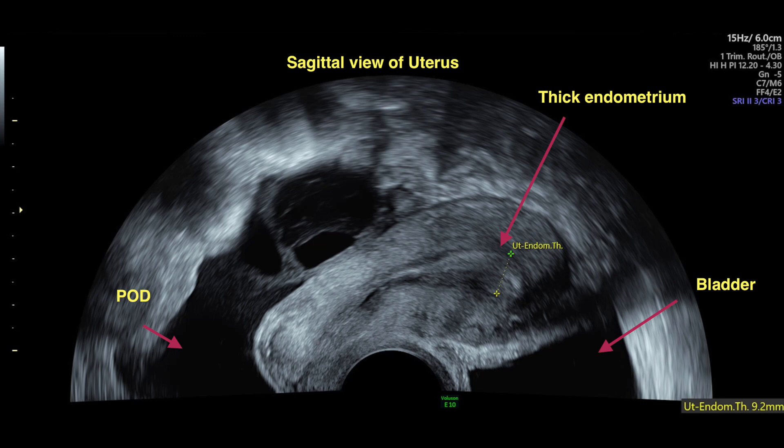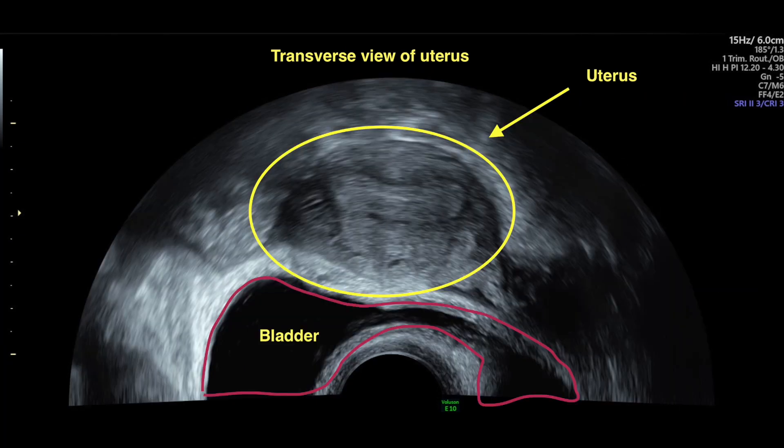This is another picture of an ultrasound performed for an ectopic pregnancy, which shows a thick endometrium in the center and a lot of fluid behind the uterus. This is the transverse view showing the uterus with a thick endometrium and a bladder next to it.